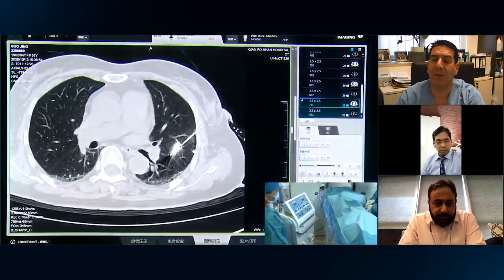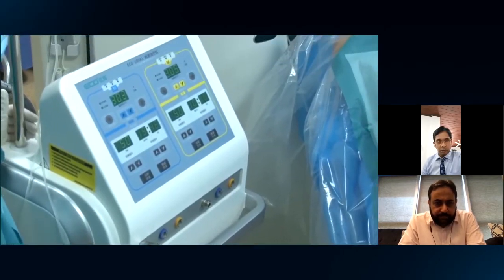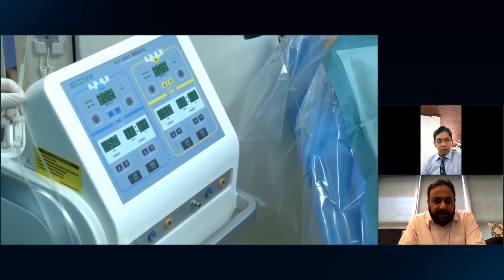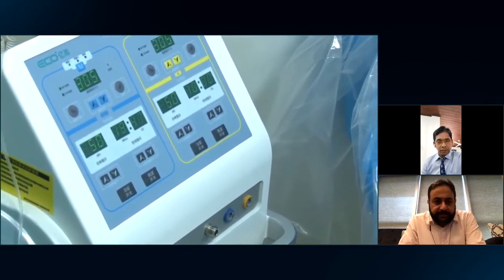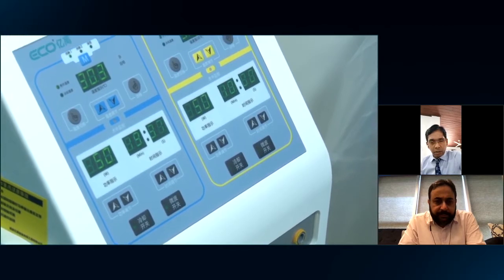How many minutes? How many watts? 50 watts for this one. For how many minutes? 3, 4 minutes.